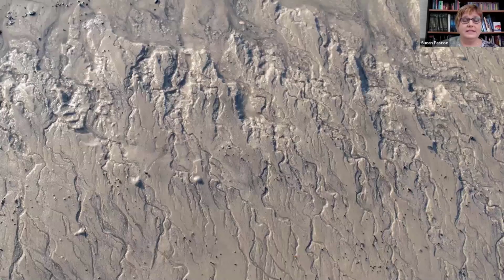So I hope that I have made it so that it's more than just this grey Martian moonscape like it was for me when I first started ultrasound. I know for a long time, I used to just keep looking and they'd go, yep, stop there. And I would just push the button and freeze, but I couldn't see the pancreas for the life of me.